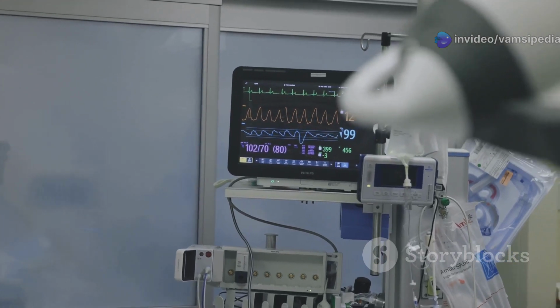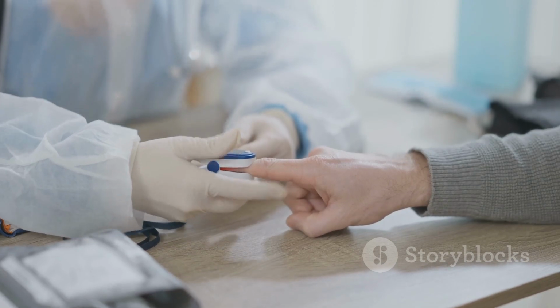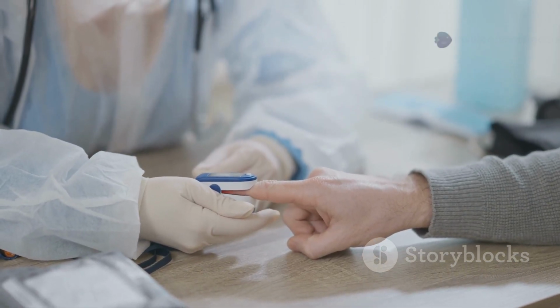Next, oxygen pulse. This is the amount of oxygen used by the body per heartbeat. Decreased values can indicate poor cardiac function or peripheral circulation issues.